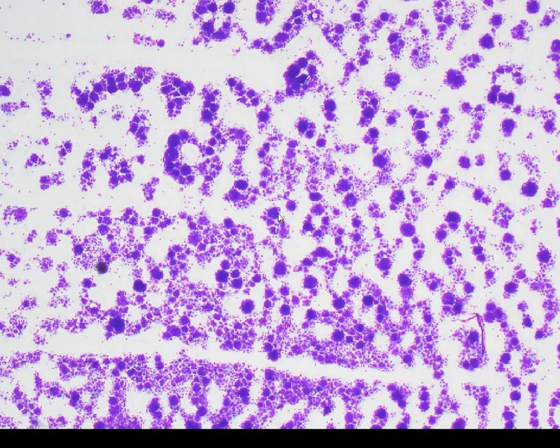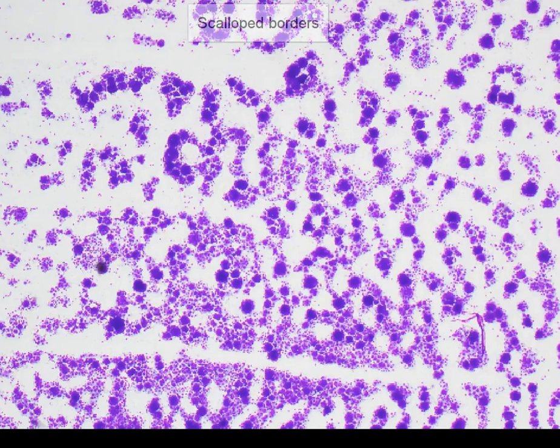Here is a low-power view of the pleural fluid sample showing a highly cellular yield. We can see that the cells are arranged in rounded clusters, and even at this power we can appreciate that some of the clusters appear to have these scalloped borders.